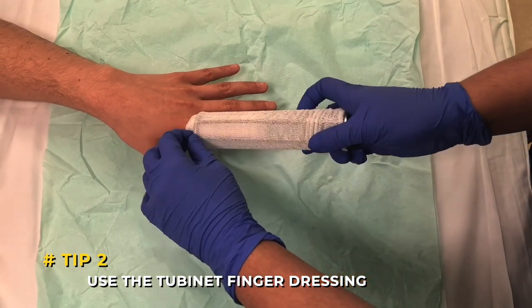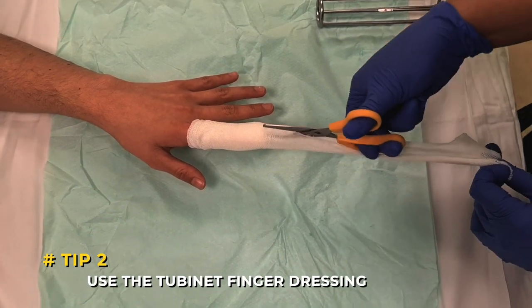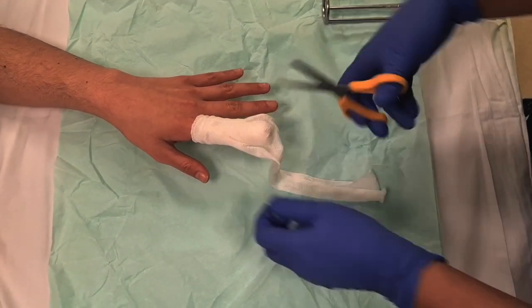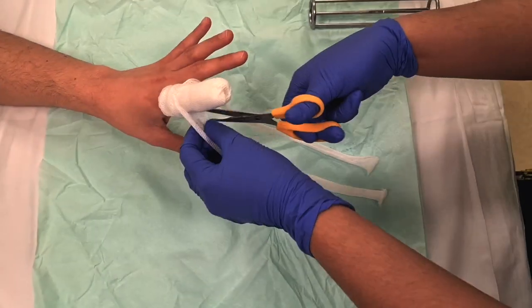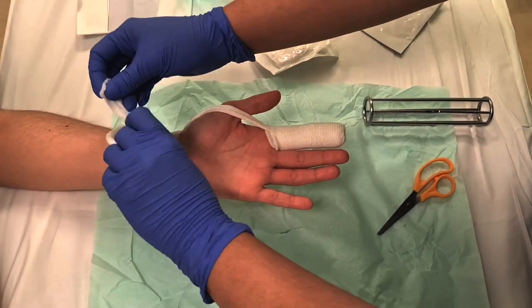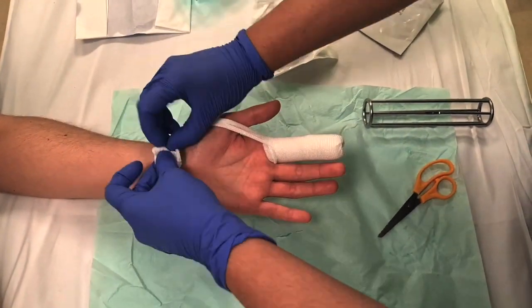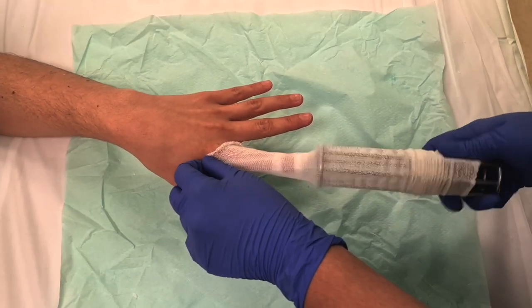Tip 2. Use the Tubinet finger dressing. They're much less painful to apply than the ones that come ready rolled, and they fit better because you can adjust the length. There are two ways to apply them, and here you can see that the dressing is being split down the middle to create a tie to go around the child's wrist, and this works really well for younger children.